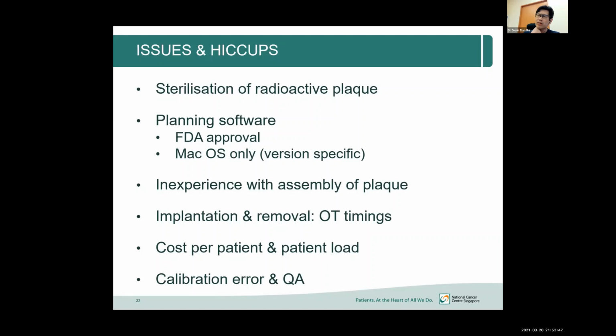In the end, we wondered if it was a big issue. There was a difference in the dose to the tumor and to the organs at risk. There was actually an increase in dose to the primary tumor, but there wasn't a significant change in the dose to the organs at risk. So it turned out fine in the end. But this was another thing that we need to look into going forward.